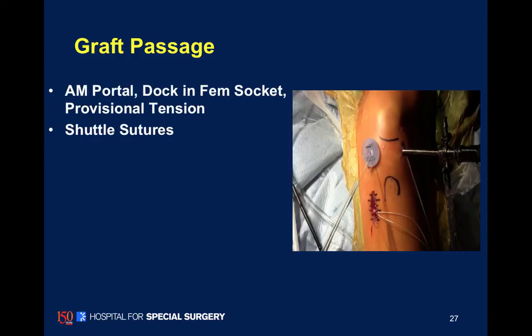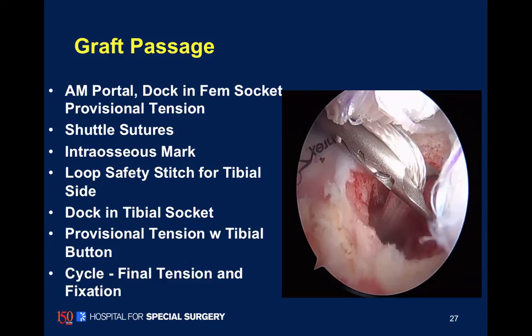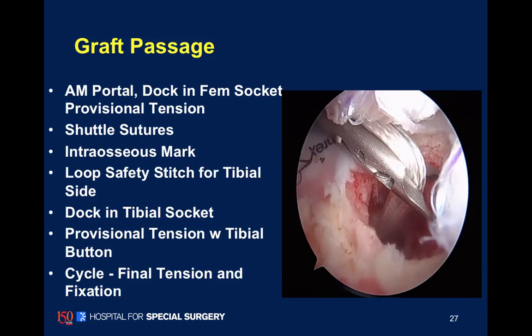Once we have our sockets prepared, we can then bring the sutures and suture buttons into the knee and flip them on the femur. We then begin tightening, followed by final tightening and cycling, and adjust the fixation on the tibia.